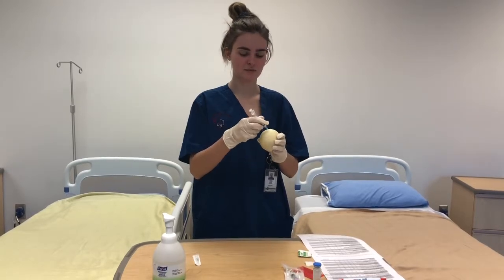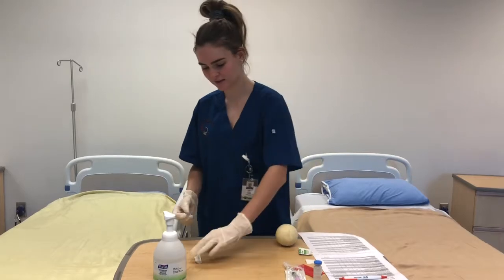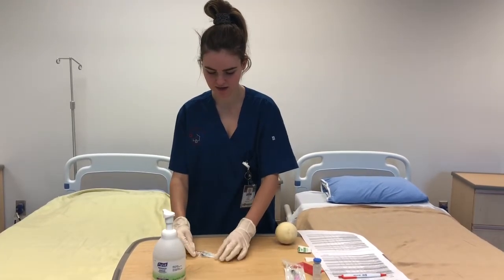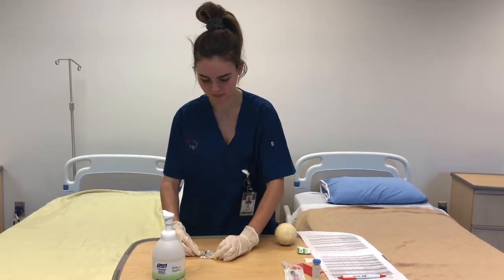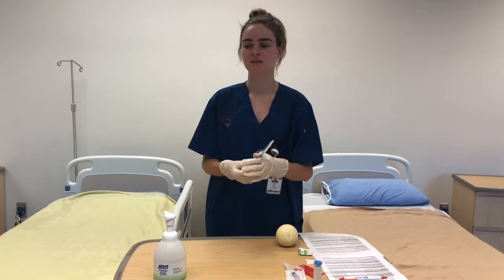Once the heparin is in my patient, I will remove the needle from the patient and insert it into the cap, just like this, and push the cap on. So now I'll be discarding this in the sharps container.